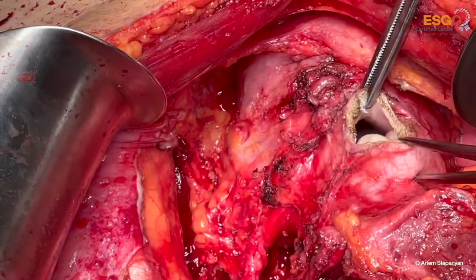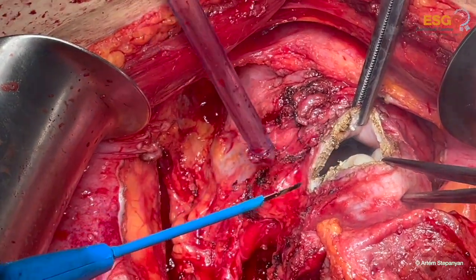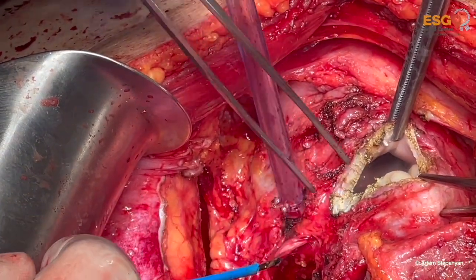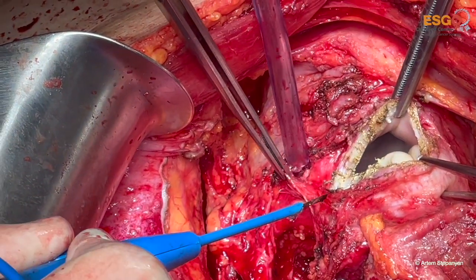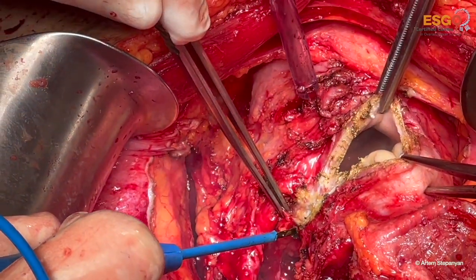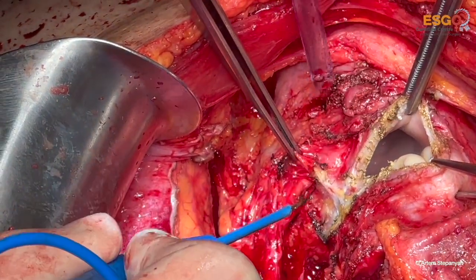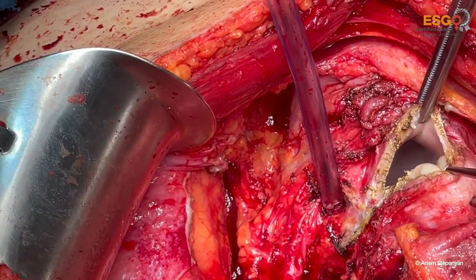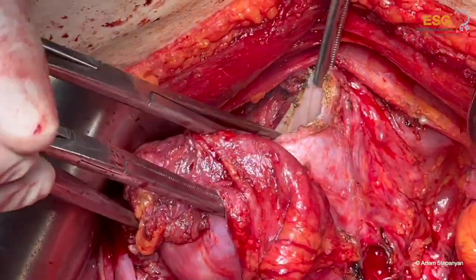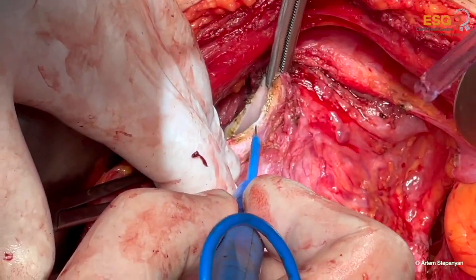Now we have everything almost mobilized, just having the uterus attached to the vagina. We cut the vagina until we reach the branches of the uterine vessels, which are preliminarily secured, but it's not the case. You have to cut them and secure them again so that we cut on both sides laterally until we reach the uterine and vaginal vessels.